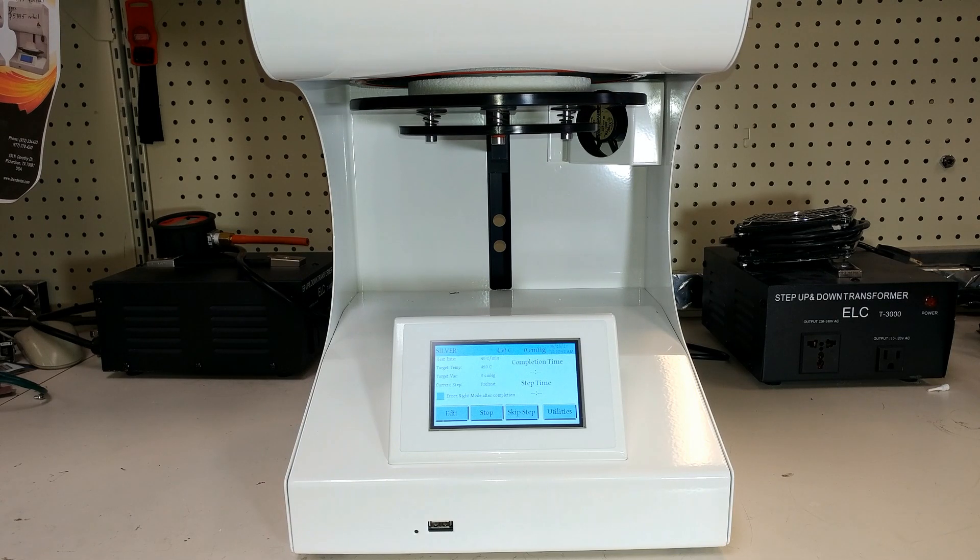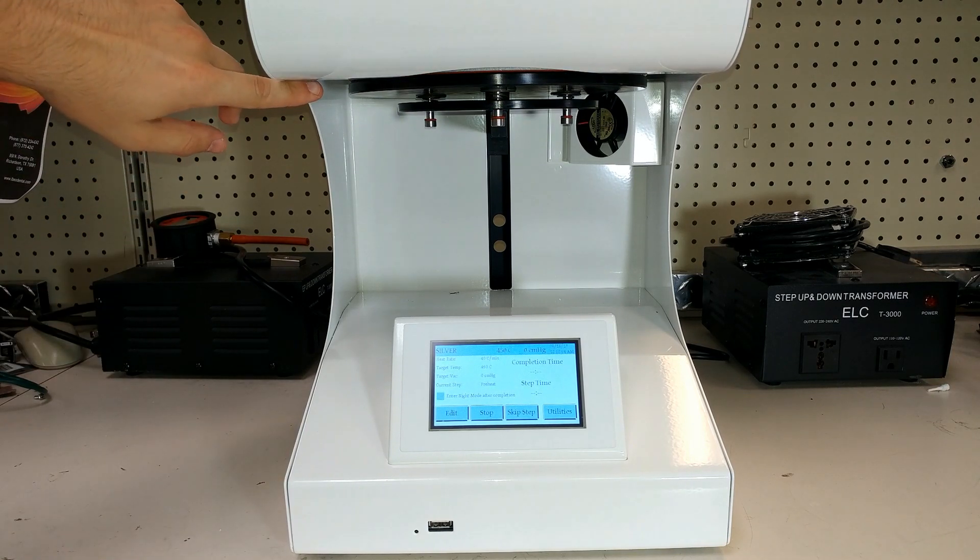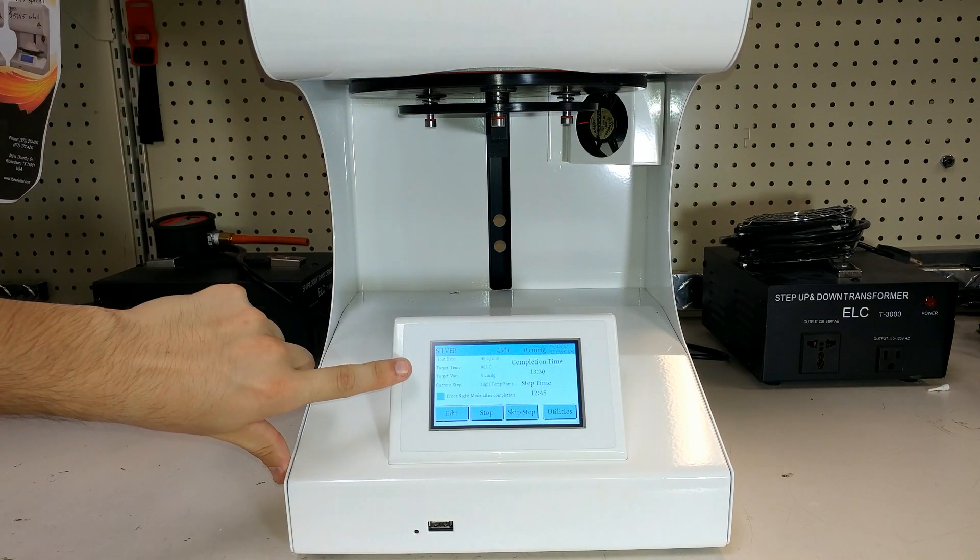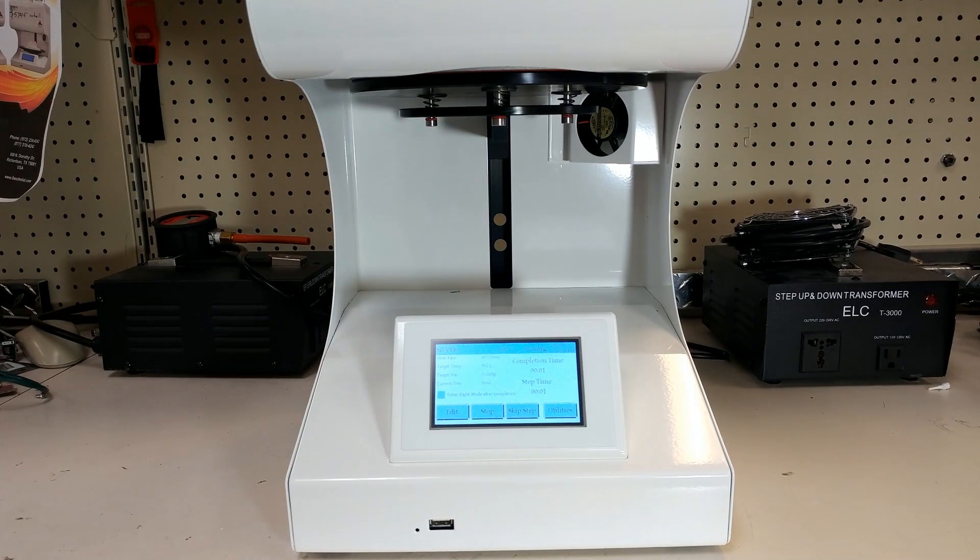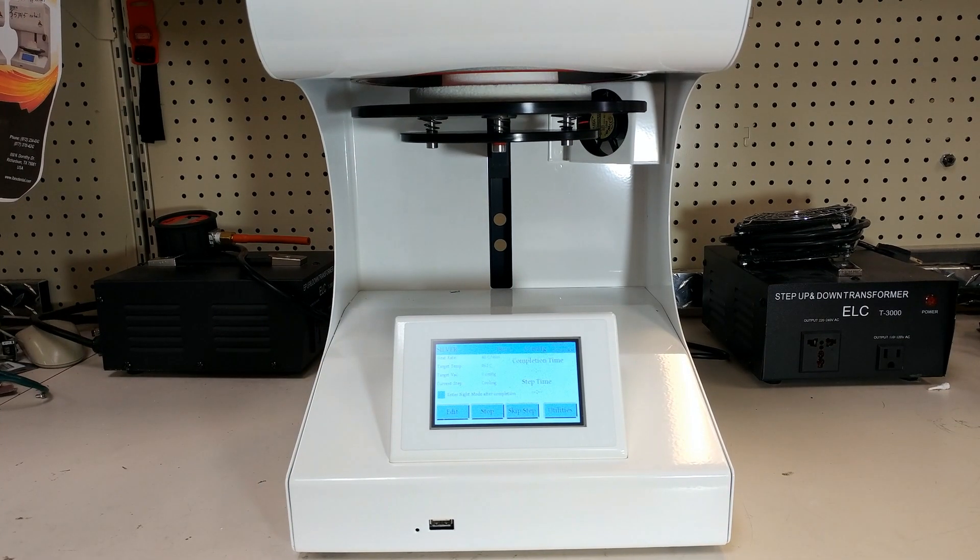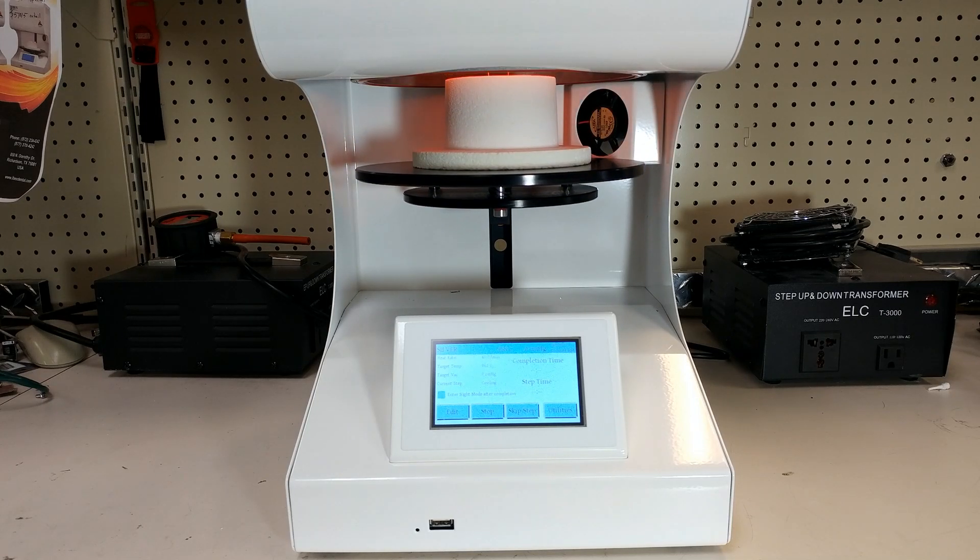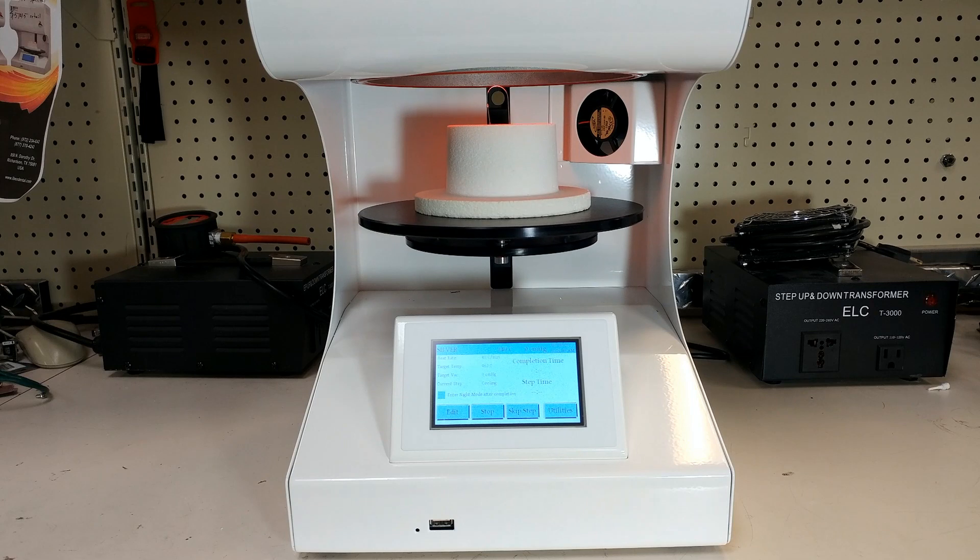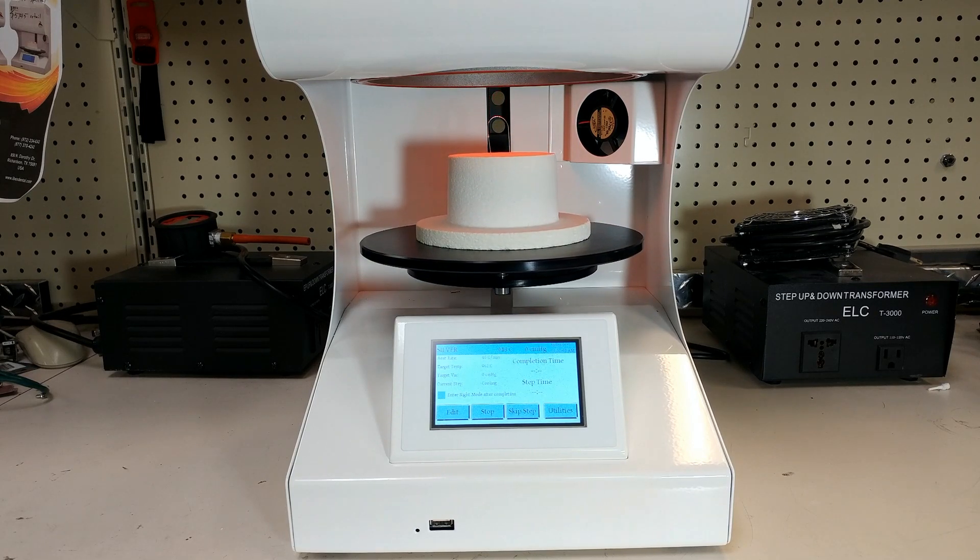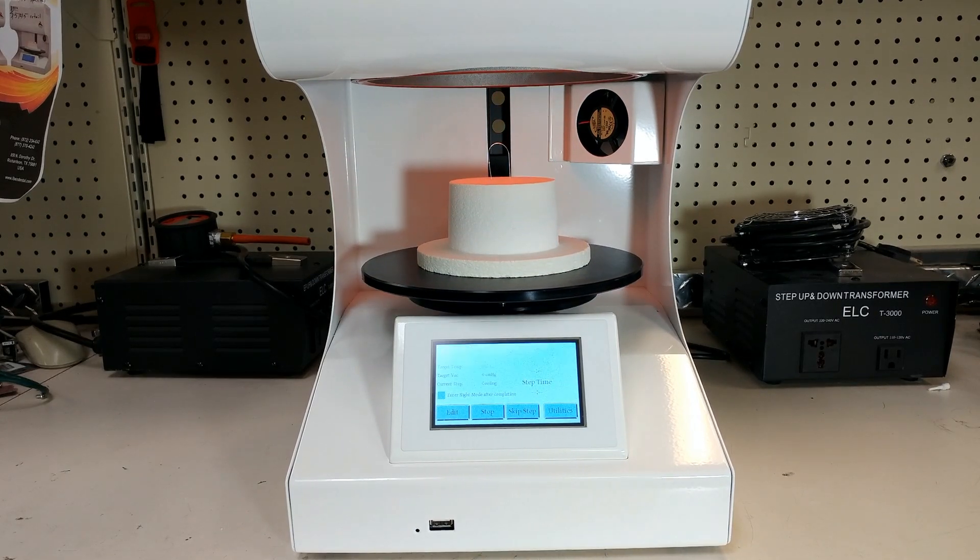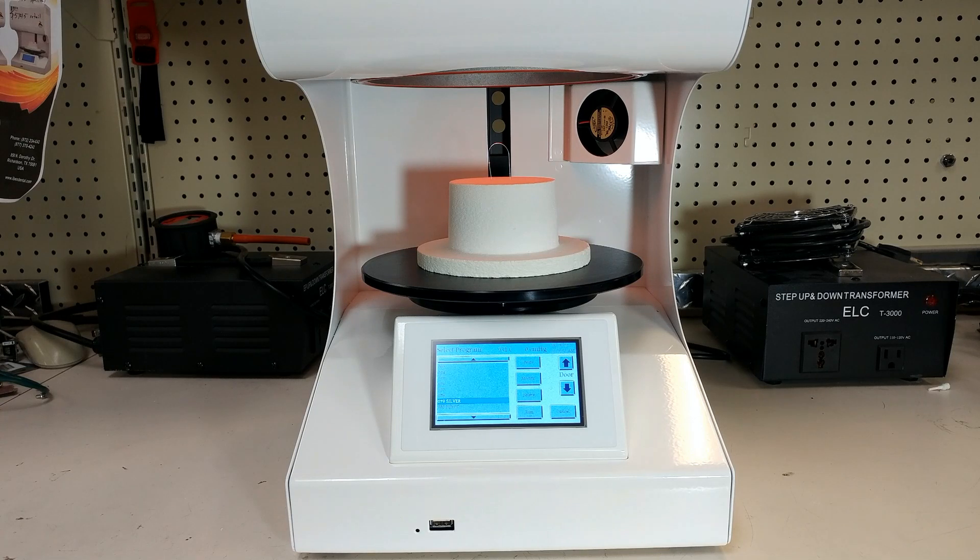As the door hits the very top and hits the upper limit switch, the program will begin. As the program completes, like any other program, the door will start to come down and you will see what you just cooked or melted in this case. What you want to look to see is how your silver melted and it will be in one of three different states.